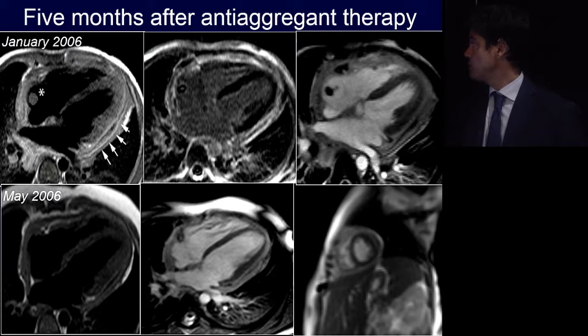When the tricuspid valve opens, it has this sigmoid motion, which was not present in an early phase. We also did real time in this patient, asking him to breathe in, and look what happens to the septum. Let me show you again. This is not a normal shape, it's a flattening of the septum.